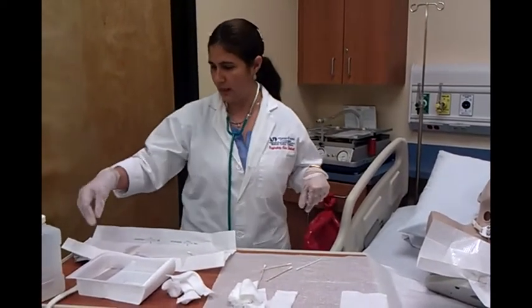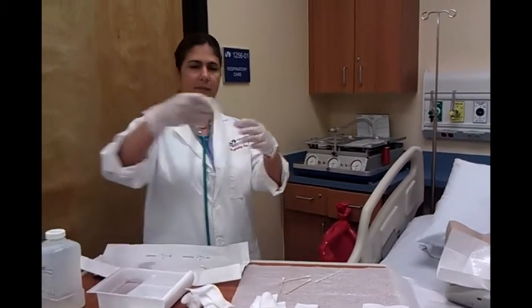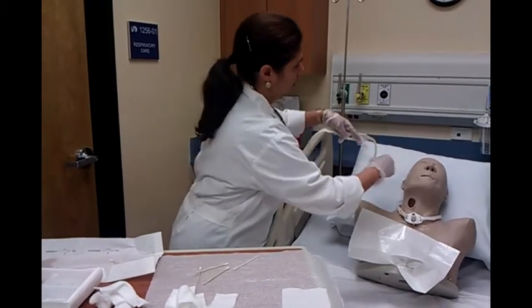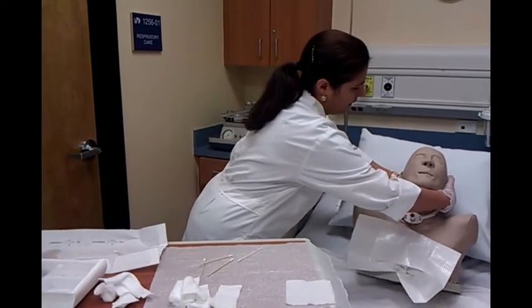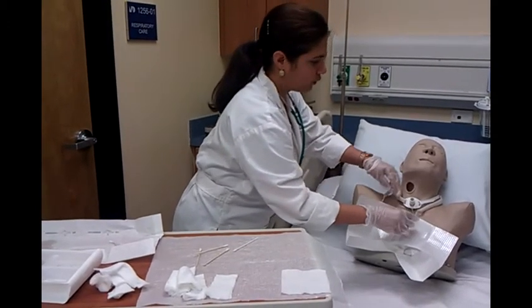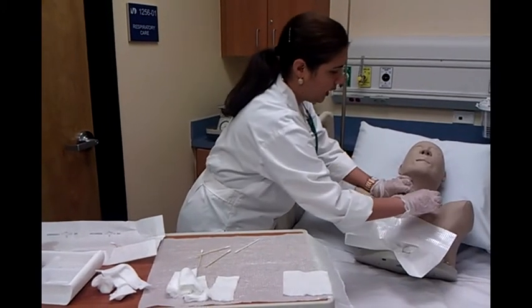Now I'm going to change the tie for a new tie. I'm going to gently turn my patient and put the tie around his neck. When I'm changing the tie, I have to hold the flange and the stoma well so it doesn't come out of my patient.